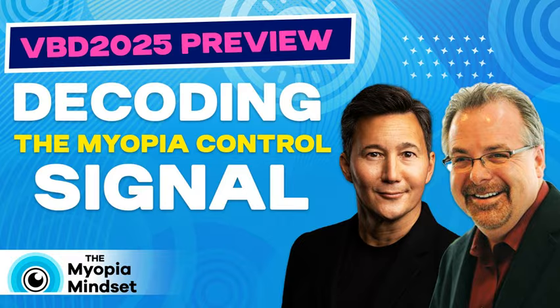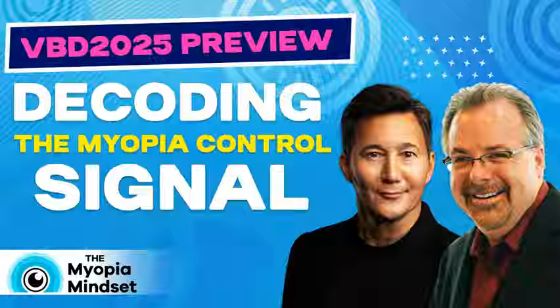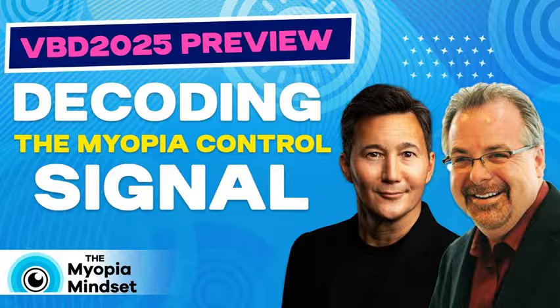So yeah, it's a pretty exciting time that we're seeing that these specific modifications to the parameters are producing better myopia control in Ortho-K. But one of the things you said, Matt, that I think was really important too, is that when we use smaller optic zones, it does produce more topographical signal to send to the back of the eye and slow down eye growth. But we also have to be sensitive, and you mentioned it, for somebody with a large pupil, they might be more sensitive than others to having those aberrations.